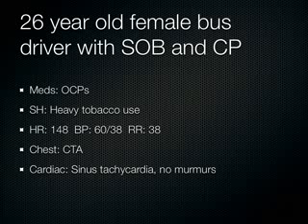Okay. So can you put someone like this in the CT scanner? You could, but... Have the medical students seen this too? No. Oh, good. Okay. So, what does a PE look like on ultrasound?